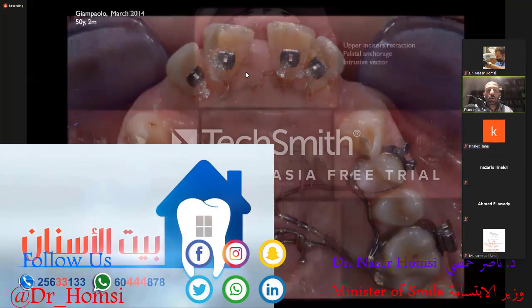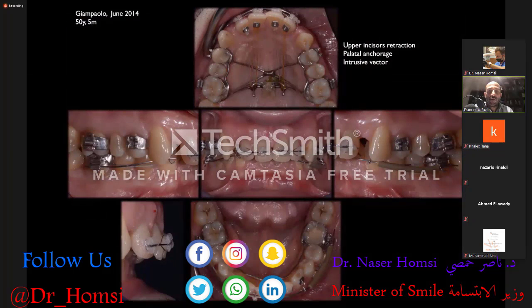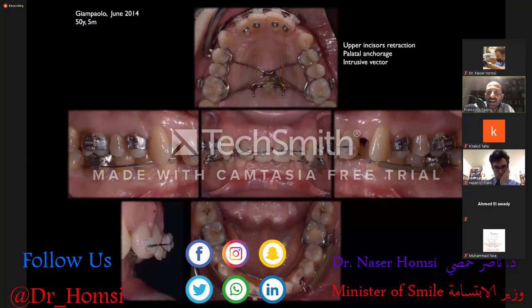So let's start to retrocline the upper incisors, and after a while teeth start retracting, and then we can go for alignment of the anterior segment, being careful not to lose the good spatial orientation, as we've seen in the initial part of our meeting together. And we have the palatal anchorage that is retracting and intruding the upper incisors.